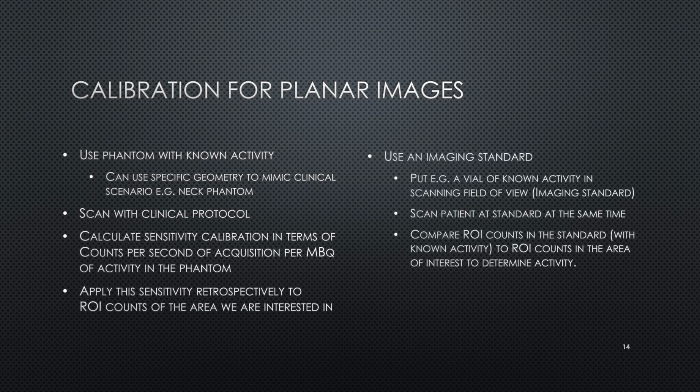Alternatively, we can use an imaging standard with a known amount of activity, which we place in our scanning field of view. We scan the patient and the standard at the same time, with a region on the standard giving a direct translation of activity in the region that we're actually interested in.